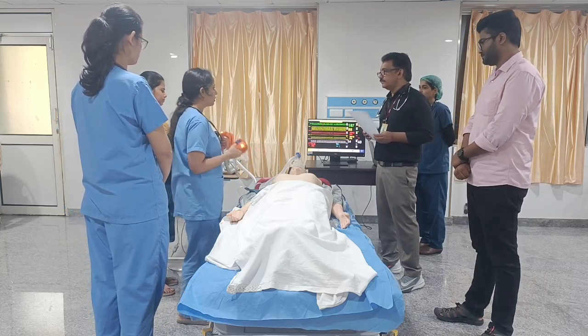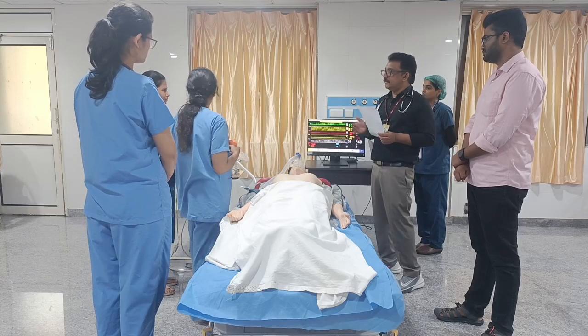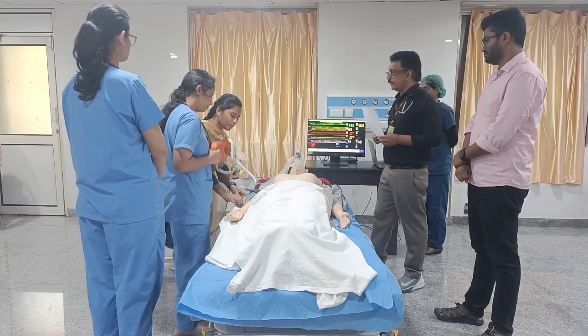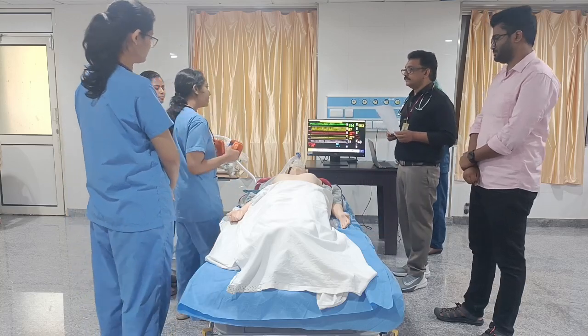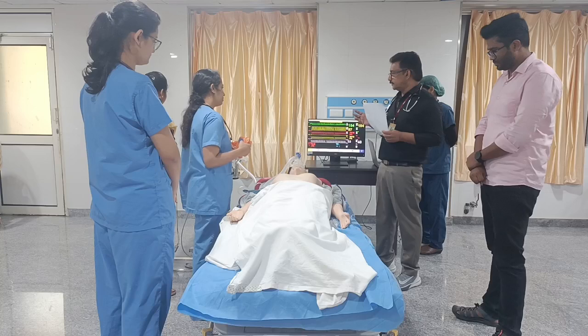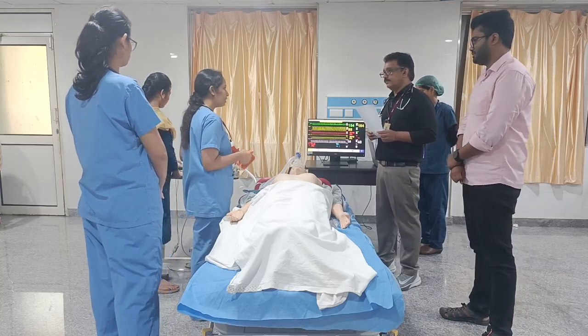Usually, you can give any combination. You can give Midazolam plus morphine. Midazolam and morphine have been given. Meanwhile we have to get ready with the crash cart also. Crash cart is ready. Okay, and then now we will charge the paddles and then give the shock.